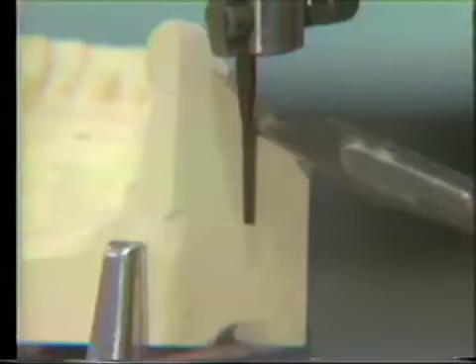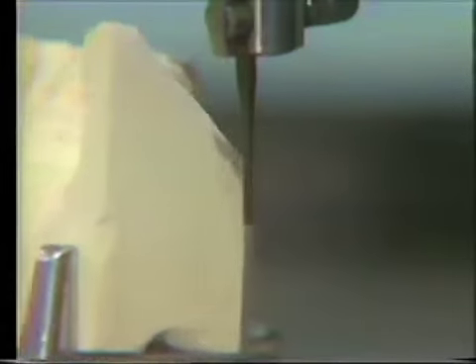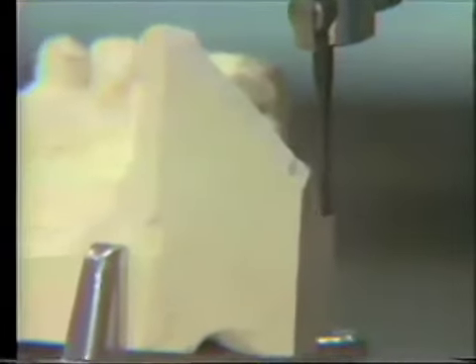The longer the mark is, the better. It will etch the cast, and I can accentuate that etching by marking it with a pencil. Now that is very visible, and we can reposition the cast in that plane.